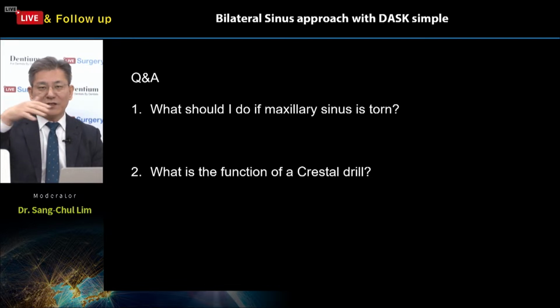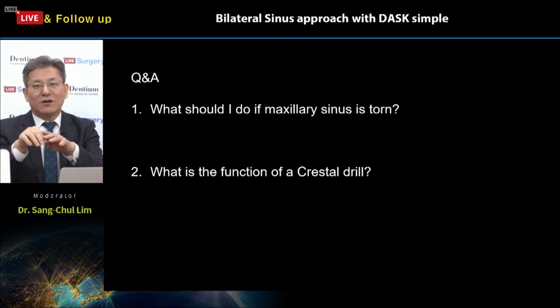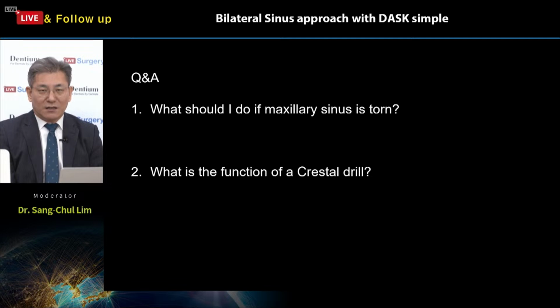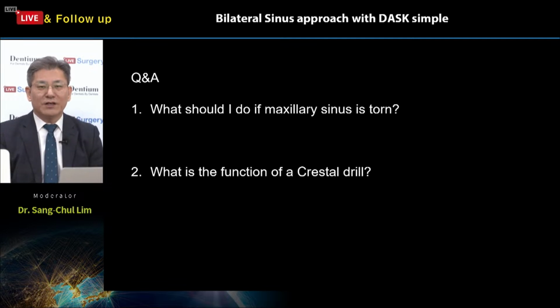Okay, so during the approach, we can see the tearing part on the sinus membrane, even if a smaller portion flips over each other, because the sinus membrane has flexibility. We cannot see the perforation area anymore after sinus membrane elevation, right?